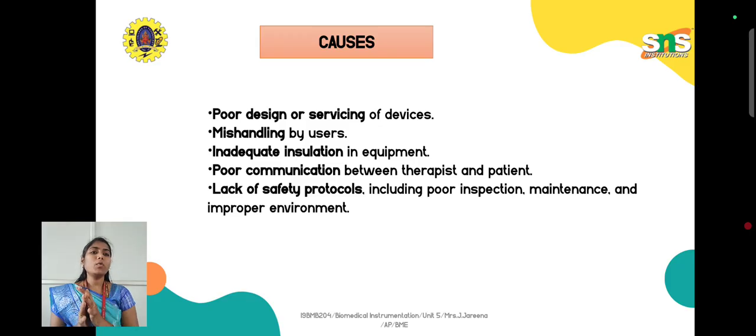And then poor communication between the therapist and patient can also be one of the reasons for the person to get shocked, because the patient doesn't know what is happening in their body, or for what reason these medical devices have been placed on our body. So they don't have any idea, they will be very anxious, very frightened, with no clue about what is happening around them.